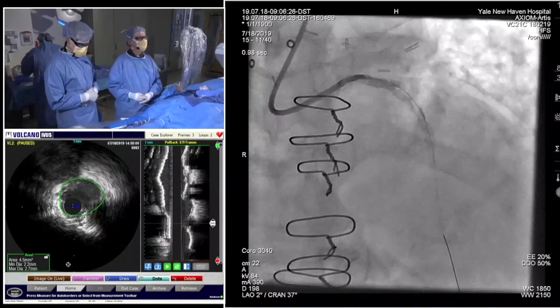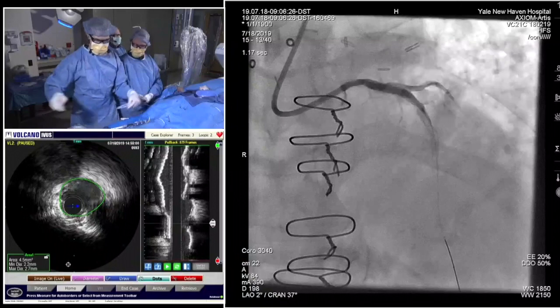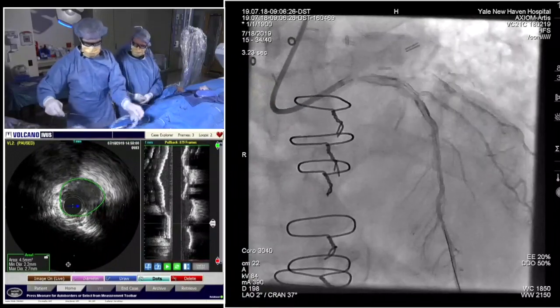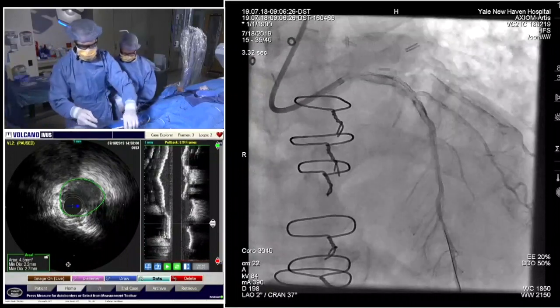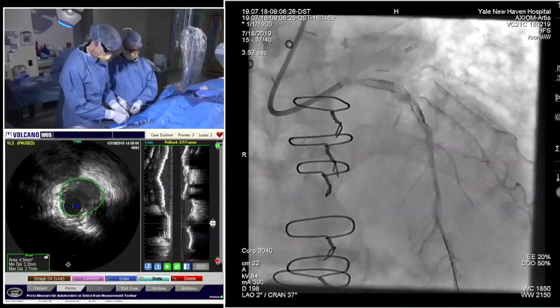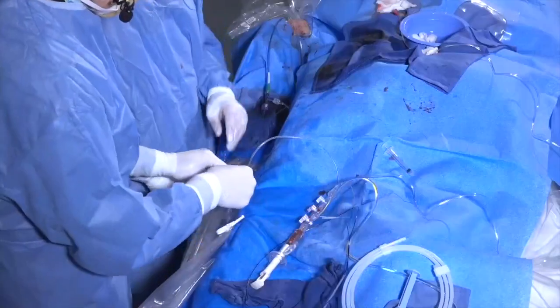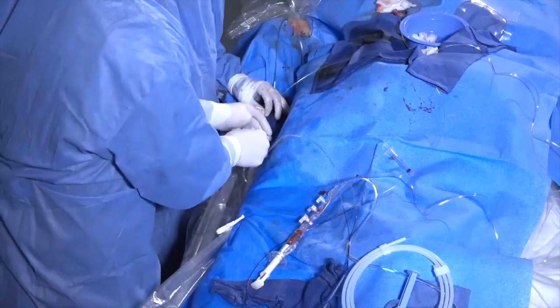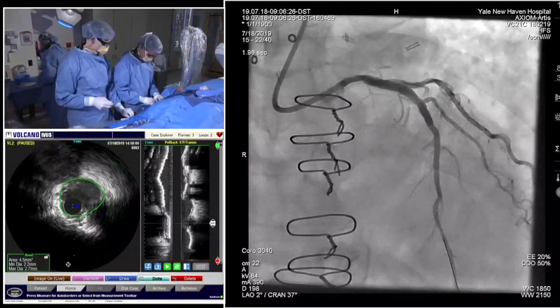No, I just think they did a very nice job, particularly all the points that were made at the beginning of the live case in terms of hemodynamic support. It shows and proves that these complex cases can be done, should be done, and there's no reason why patients should be denied therapy like this. You just have to be thoughtful, understand the potential ups and downs of a case like this, and try to anticipate all the potential issues as they have done. It's a really nice demonstration of what we can offer nowadays to these patients.